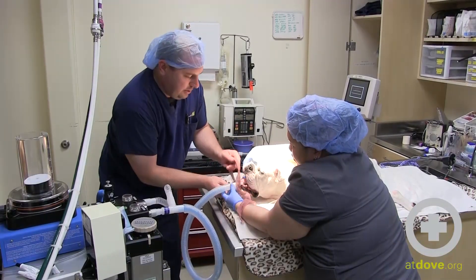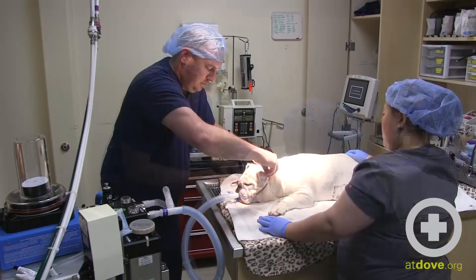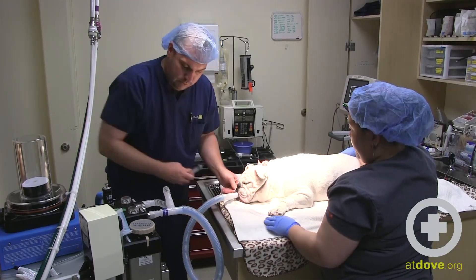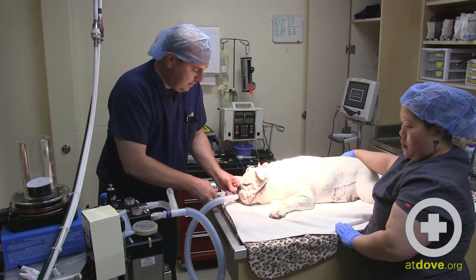I just intubated this dog for surgery and I am now tying in the tube. I will blow up the cuff to the appropriate place — getting a little bit of air, so I'm going to inflate a little bit more.